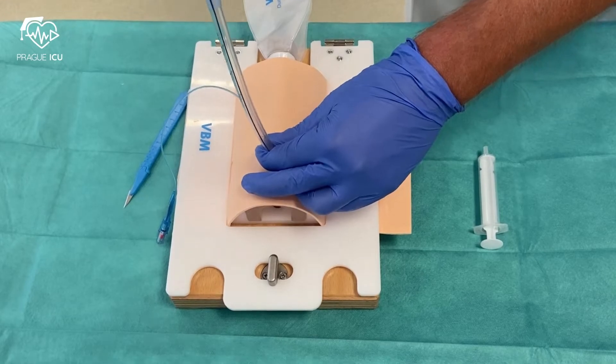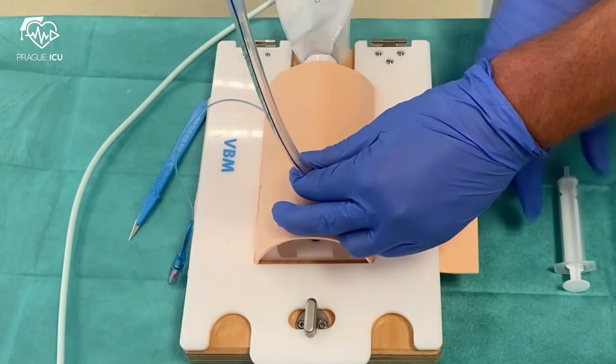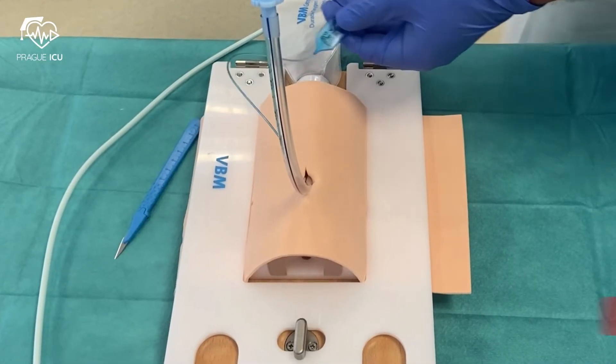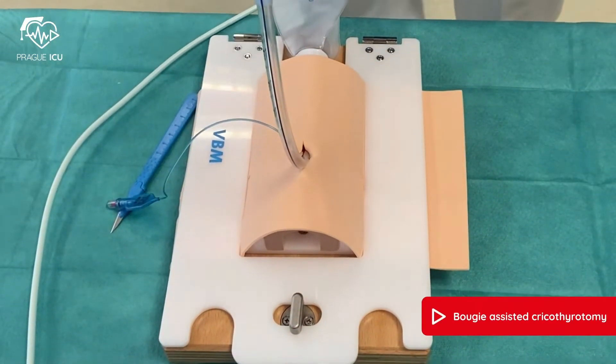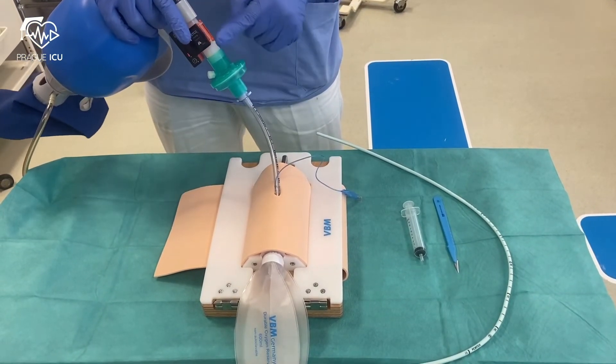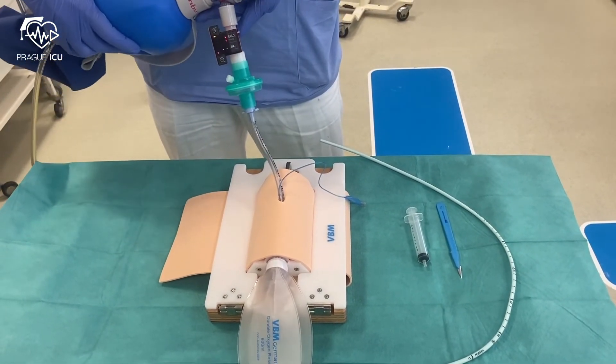Remove the bougie and inflate the cuff with the prepared 10ml syringe. Now you can start ventilating the patient, always with end-tidal CO2 measurement.